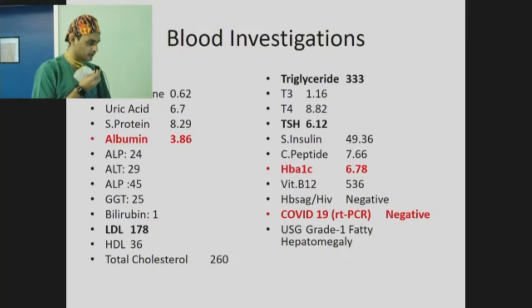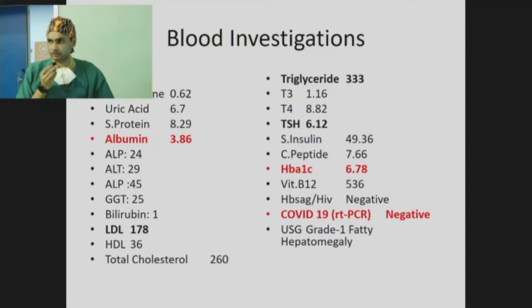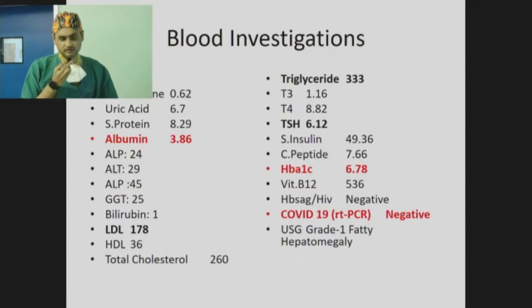So as per the routine protocol, Dr. Mohit Bhandari will be showing you the intra-op endoscopy to rule out any pathology before starting the surgery, because as he said in his lecture, we can have a change of plan if at all any pathology has been detected in the intra-op endoscopy. So now you will be seeing the intra-op endoscopy picture. So over to Dr. Mohit.